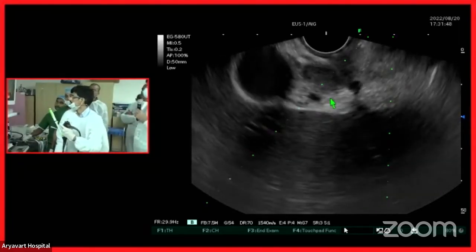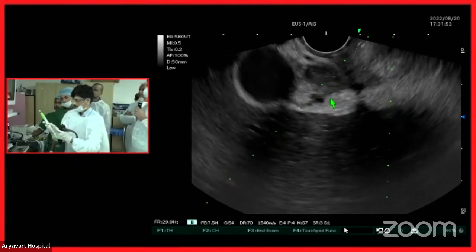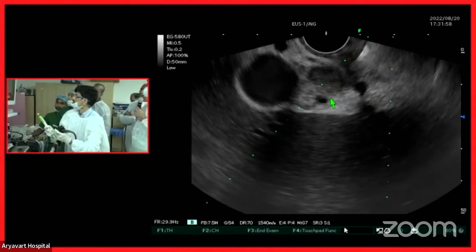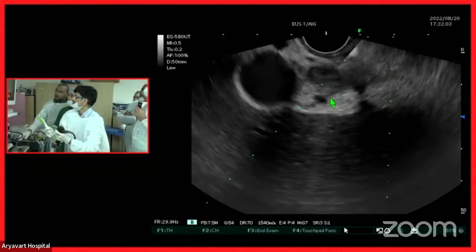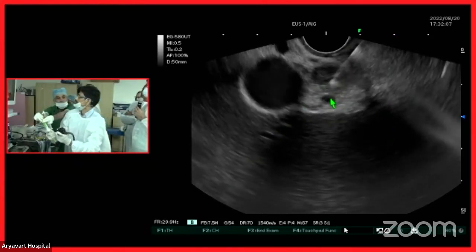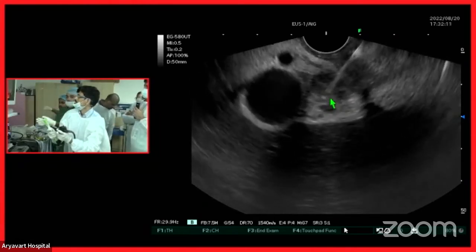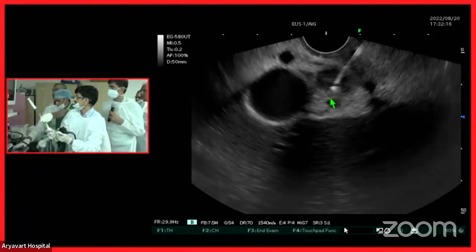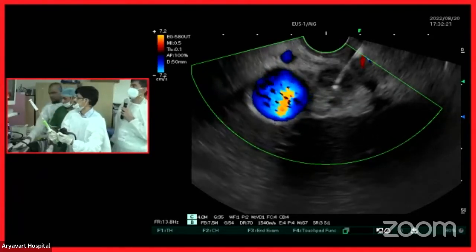Okay, let's go. Can somebody give me a Doppler just below my needle, please? Yes, okay, fine. Thank you.